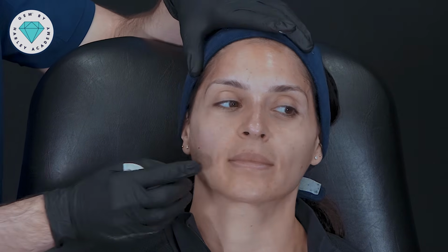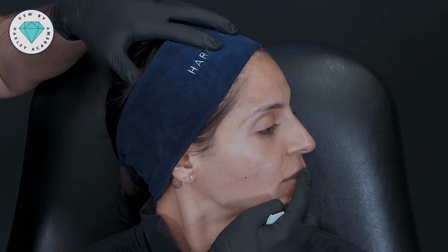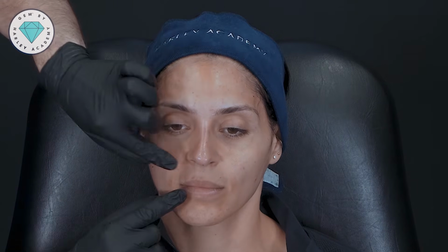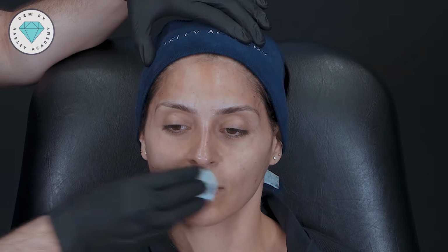What I would like to do is just create a bit more projection in the top lip. And the reason for that, again, if I can show you on profile, is the lower lip is very beautifully projected. Upper lip is slightly under projected. And so I'm just going to use a medium G prime product, mildly define. I'm going to use a needle, and I'm just going to pop out the upper lip and maybe do a very, very small amount in the bottom lip.